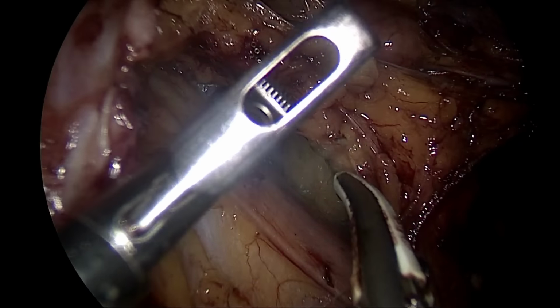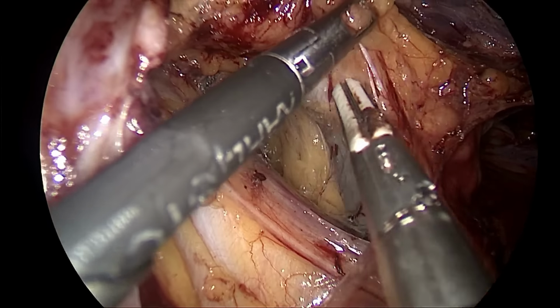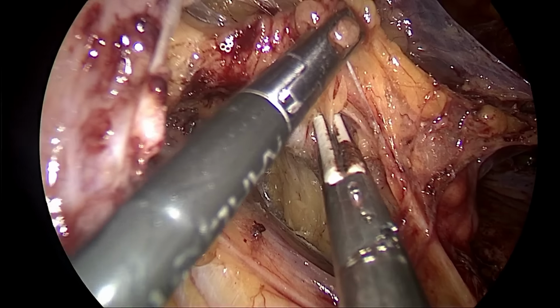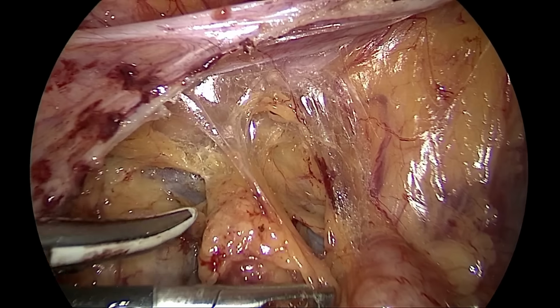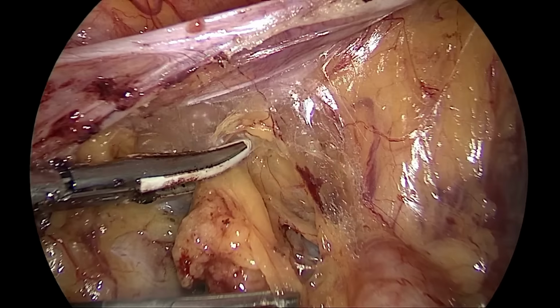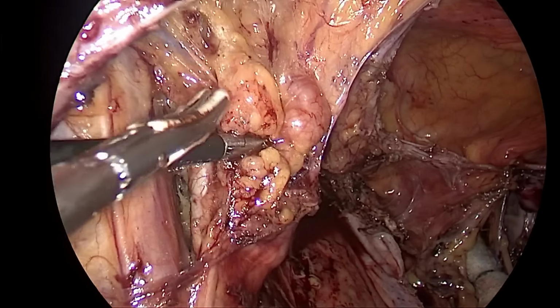That's our external iliac artery. So now I am trying to separate the lymphatics from the external iliac artery, and that is the deep circumflex iliac vein below my ligature. There is a big node on top of that.